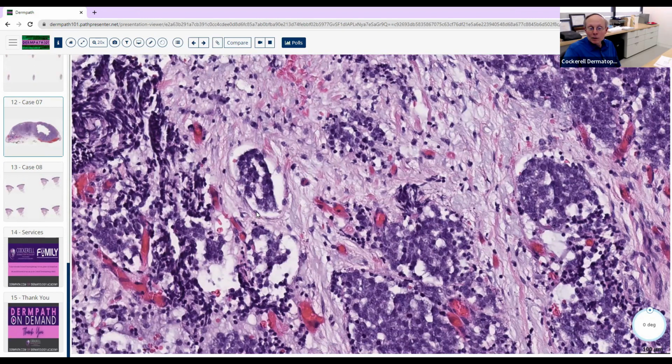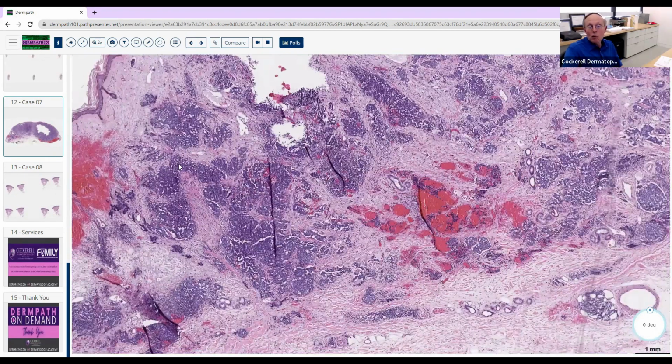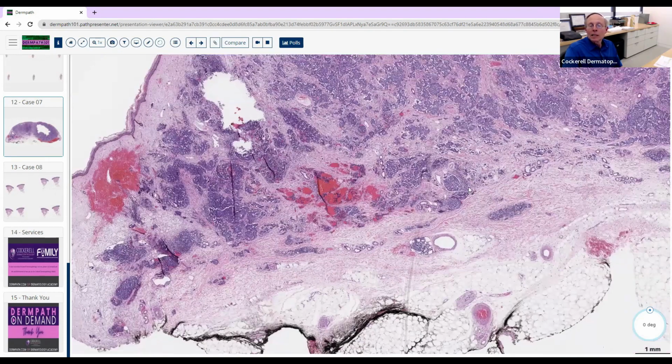See the endothelial cells here? Oh, yes. Blood vessel. So that's actually a sign that the neoplastic cells have gone inside a blood vessel here. Oh, not a good thing. It could either be the tumor going into the blood vessel and going to spread throughout the body, or possibly that's coming secondarily. So this was a neuroendocrine carcinoma here. I believe this was a primary Merkel cell in this case.